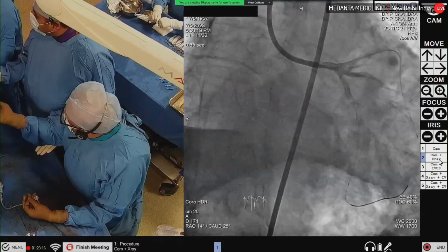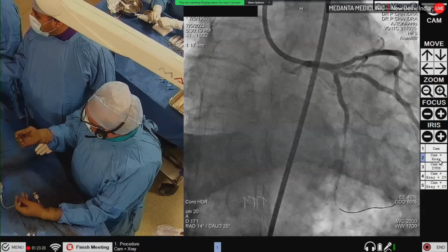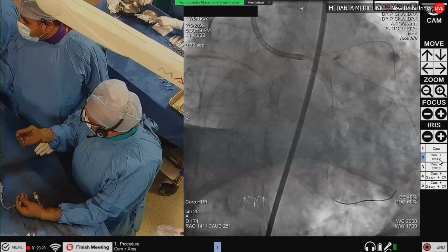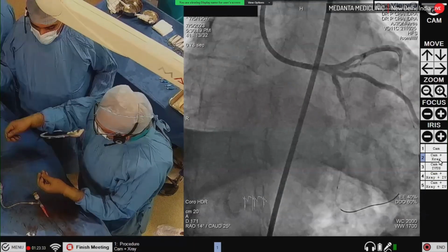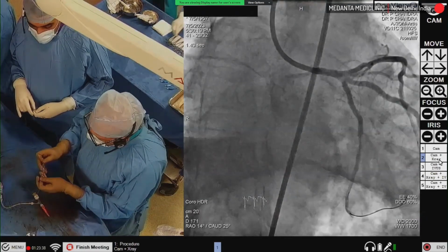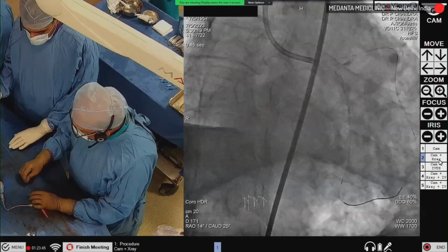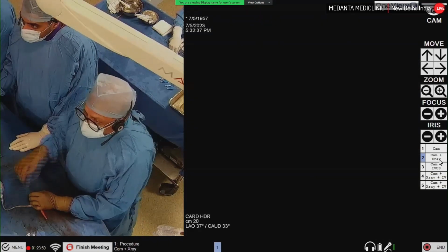So this is the SR Summit stent, 3.5, 28. And this stent also has an open cell design. So generally the side branches are less affected, but we will see. I cannot promise anything, but we can check. Okay, connected.